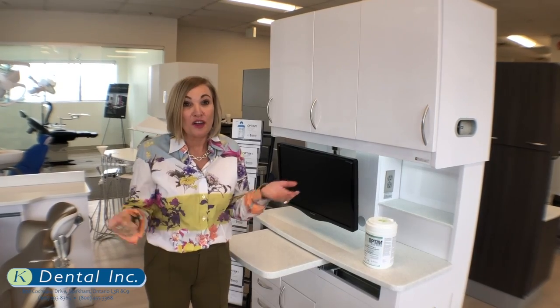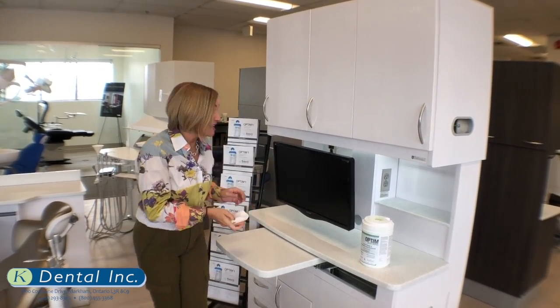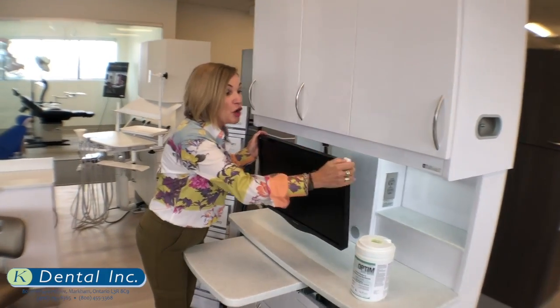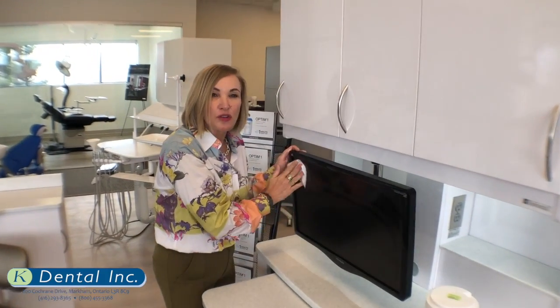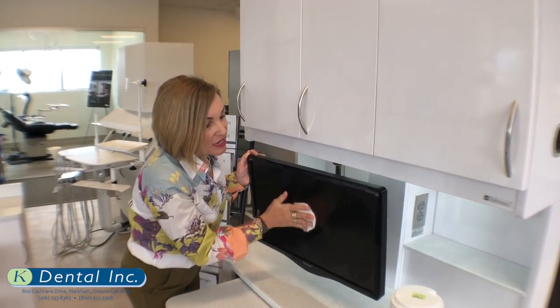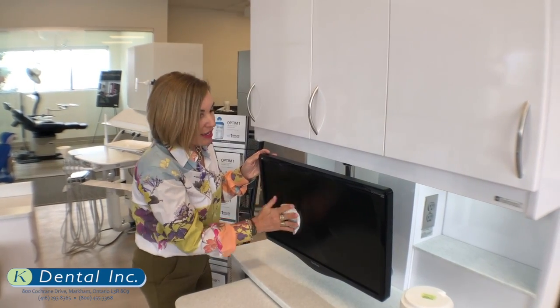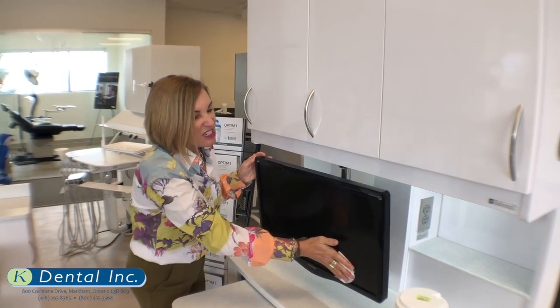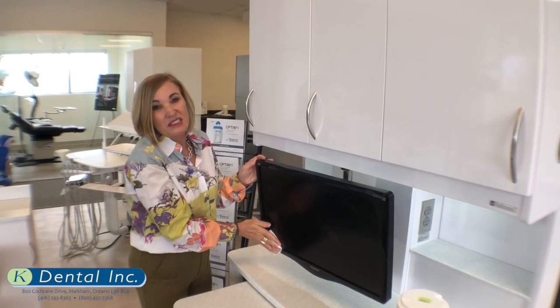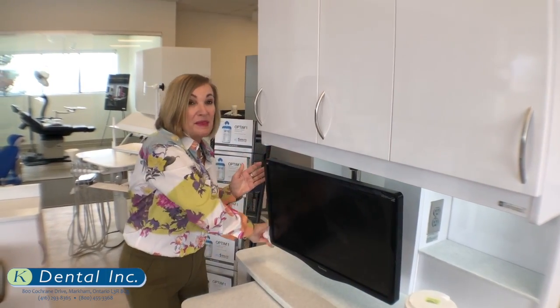It's safe to handle. The bulk of the time we're wearing gloves anyways when we're disinfecting surfaces. But it's safe, and there are no VOCs — no volatile organic compounds. Where that becomes an issue is for people that have allergies and can be affected by different volatile organic compounds. They won't be, and they'll be quite happy that you're using a disinfectant that they're not reacting to.